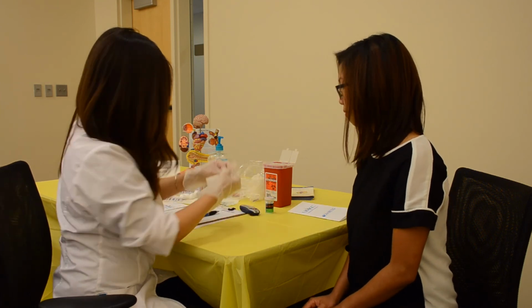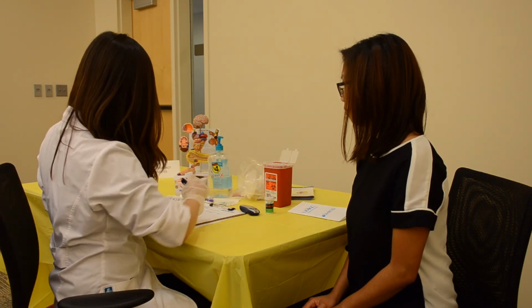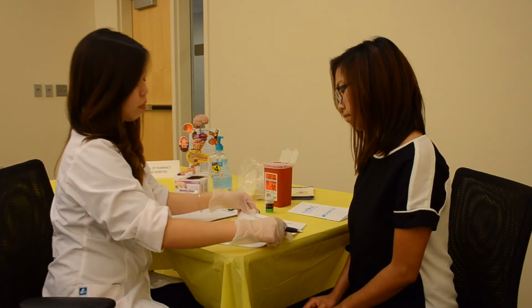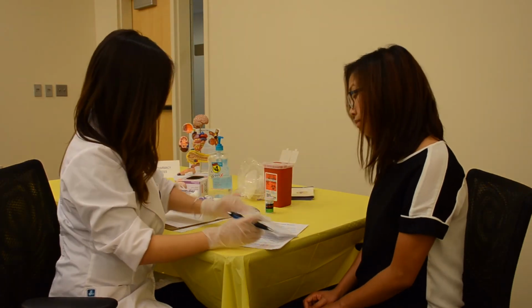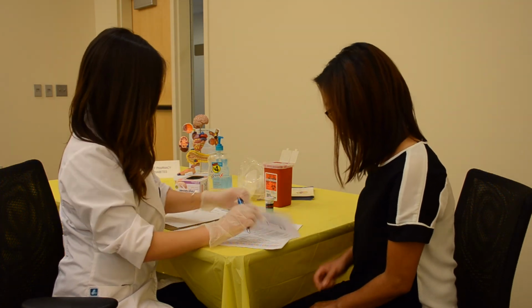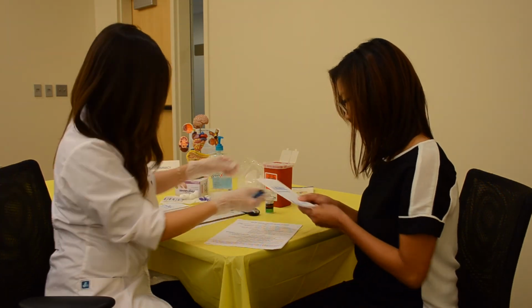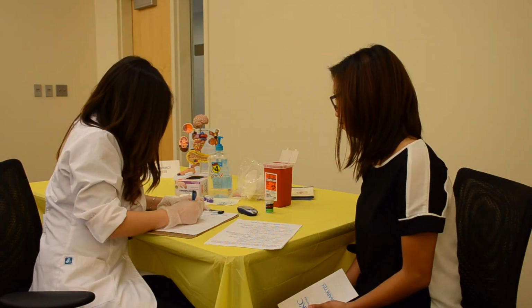You will use the interpreting results packet to determine the results of the reading and educate the patient about ways to prevent or slow the development of the disease and the signs of hyperglycemia. If they already have diabetes, you can discuss ways to manage it effectively in addition to educating on signs of high and low blood glucose.